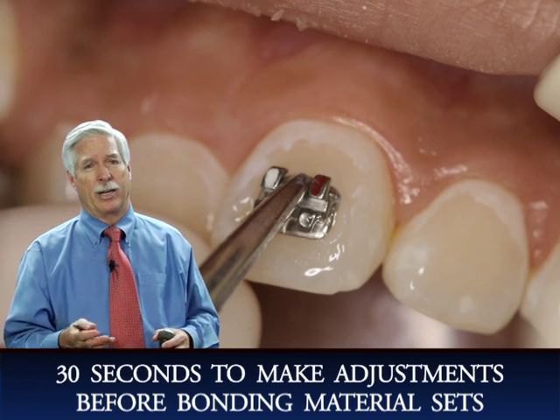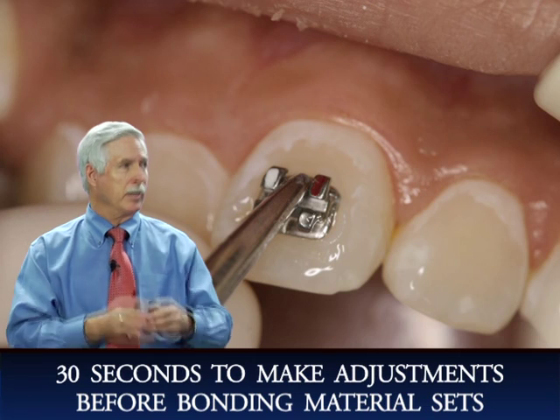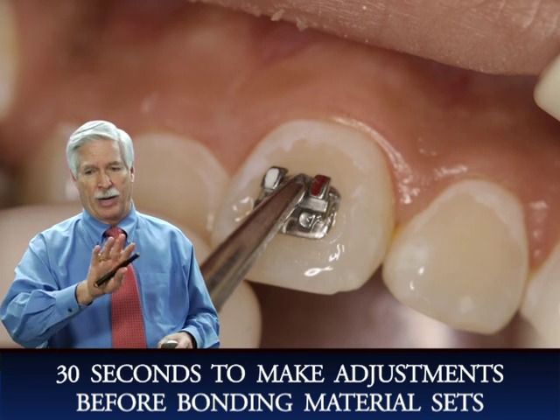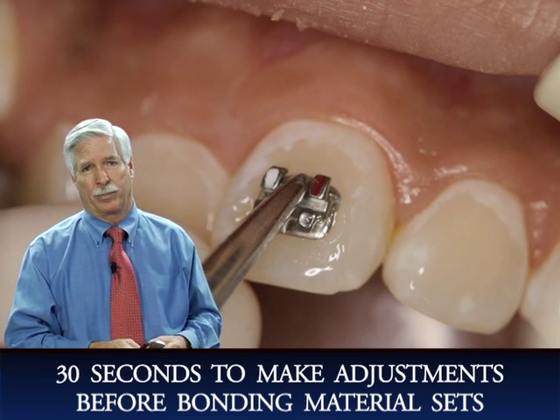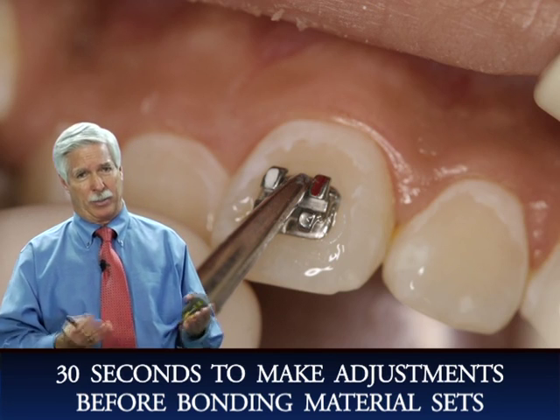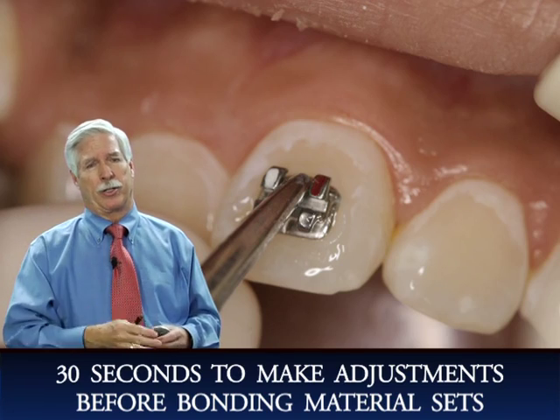Okay, 30 seconds in which to change the bracket position and make sure it's just perfect. And that's quite a bit of time. If you go over the 30 seconds, you'll find that the bracket will be very difficult to move, and if you keep moving it, the bond will fail. So make sure you take your time, but you've got 30 seconds per bracket. So that's lots of time to get it exactly in the right position.